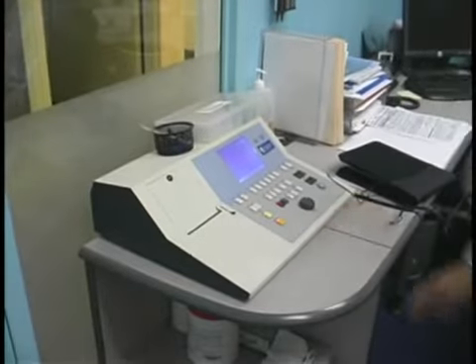I don't know if that's going to be tight enough. And then we just go over here. So for this test, you have to have a hermetic seal.